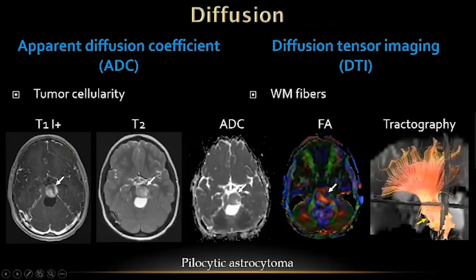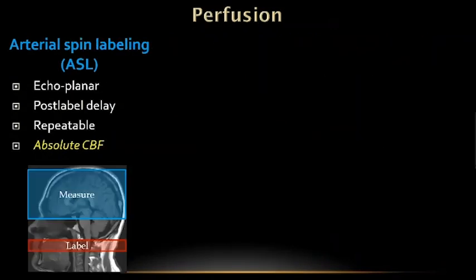So some of the advanced techniques that may not be as familiar to this audience, and we're talking now about magnetic resonance imaging, which uses magnetic fields to image brain tumors. You can look at tumor anatomy, but you can also look at things like density and also white matter fibers. So how do the critical fibers pass through the tumor, which is important for the surgeon when they're looking at function and preserving function when resecting a tumor. You can look at tumor flow as well.